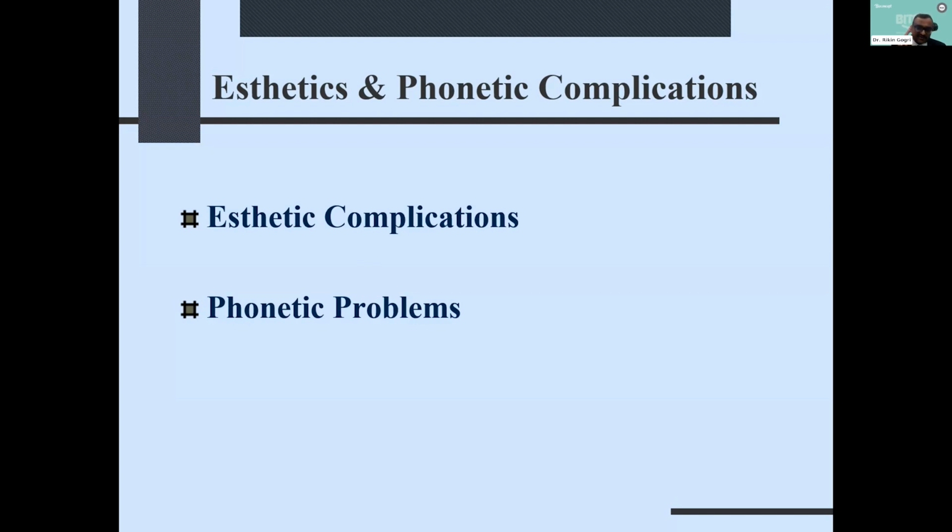When there is deep bone loss, that happens especially in the upper maxillary region, when the crestal bone loss is too much. What happens is when you're restoring one tooth, that prosthetic will look too long and the adjacent natural tooth will look too short. So in such cases, you have to coordinate with your lab technician and tell him to use the pink ceramic or something and modify the prosthesis so that the aesthetics are not hampered.